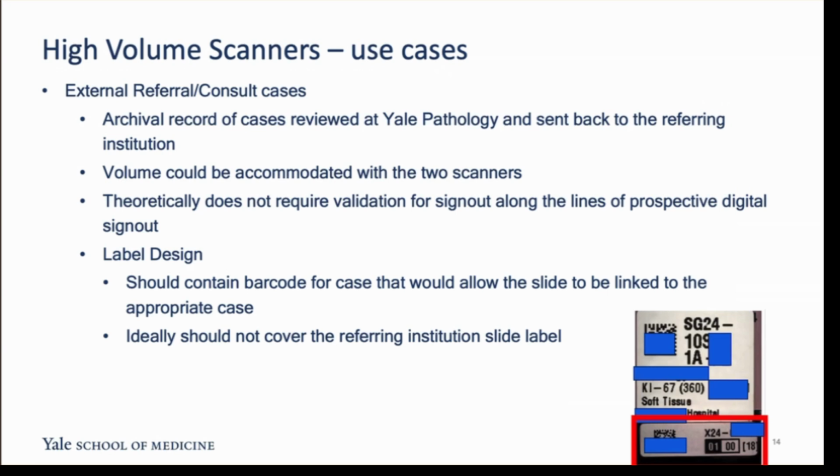There was a little bit of an engineering problem here for us. What we wanted to do was design a label that would help us associate the case in Pathology Portal, at the same time not obscure identifiers from the referring institution. In order to do that, we first settled on a small label, and it actually was trickier than you would think, because not all manufacturers manufacture these kind of labels. And then within that, we had to do some customization of the fonts and the 2D matrix code so that it could fit within that label.